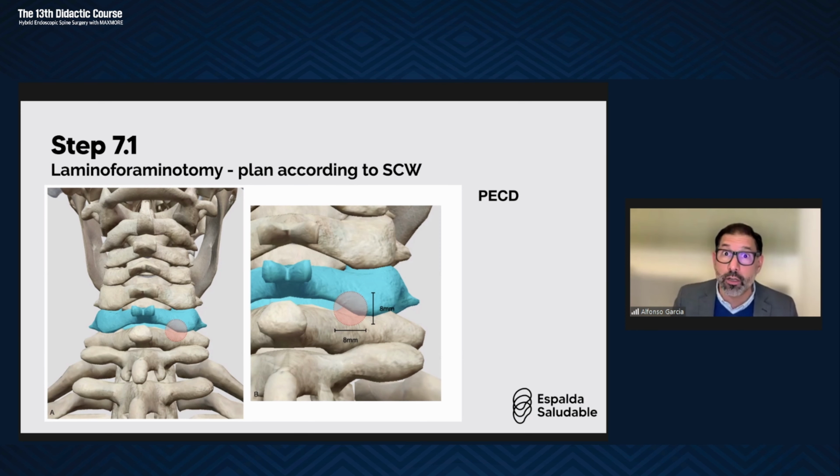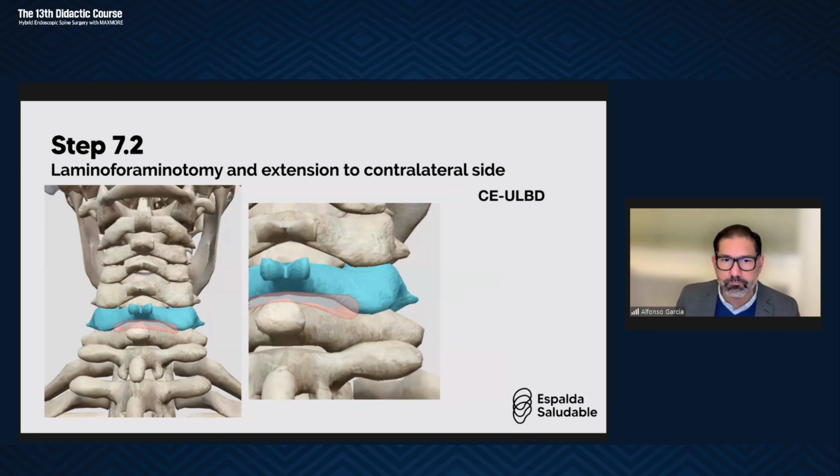We just saw earlier in the talks that inclinatory laminotomy conserves more bone, and I do recommend this as a next level. But if you're using a laminotomy just for single level, be aware not to resect too much lamina.